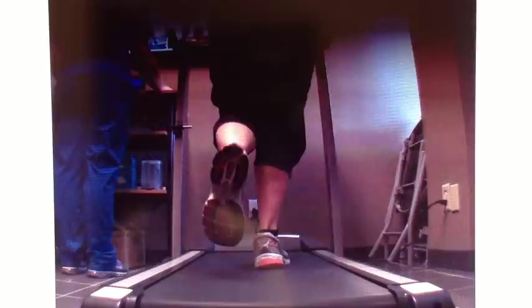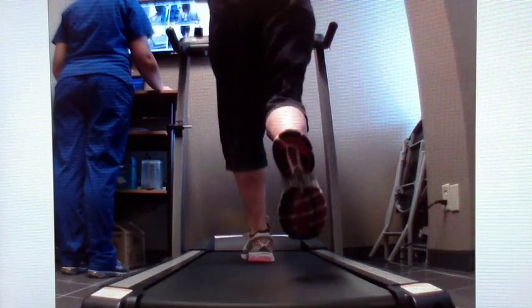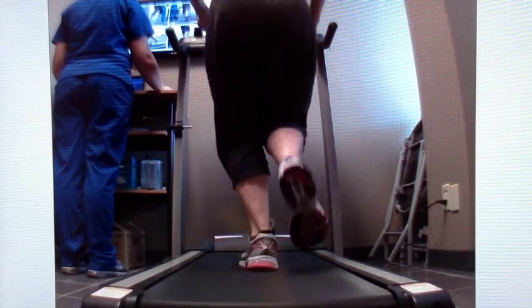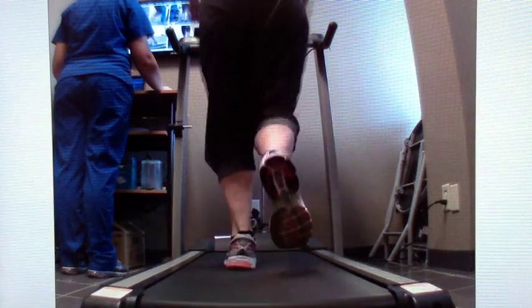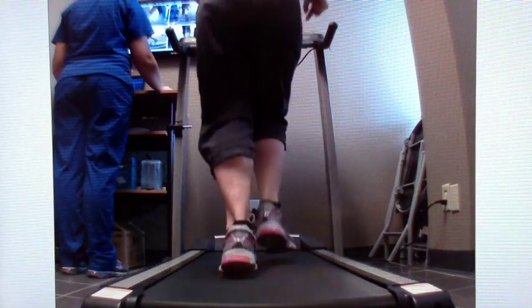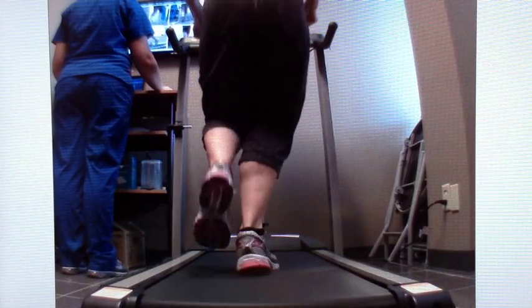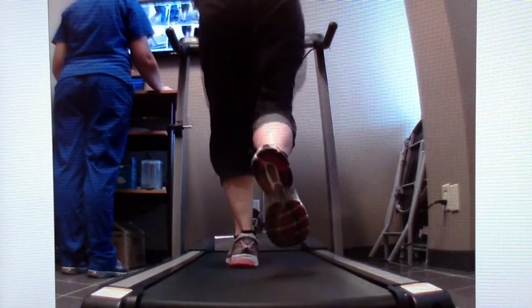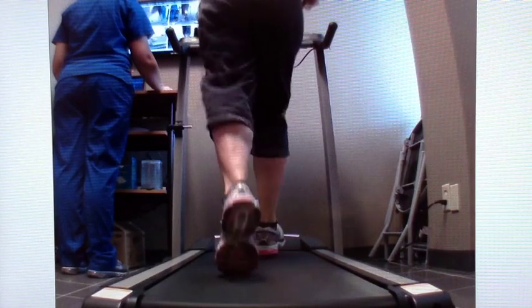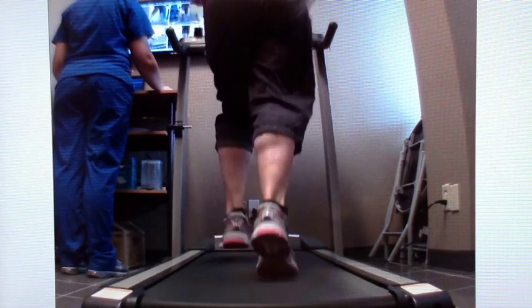The next two videos illustrate the effects of wearing old worn out footwear. Many patients present to the office with foot, knee and back pain that is directly related to wearing old worn out shoes. Note how the shoes in both patients are literally caving in medially and have completely broken down when they are walking or running. The videos allow us to provide immediate visual feedback to the patients as to the cause of their foot problems.